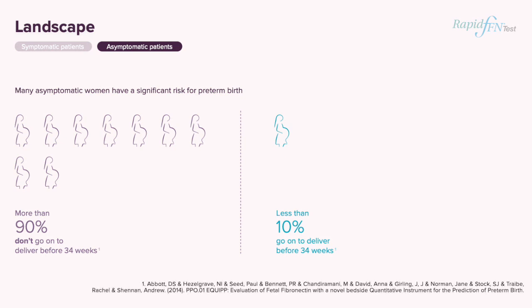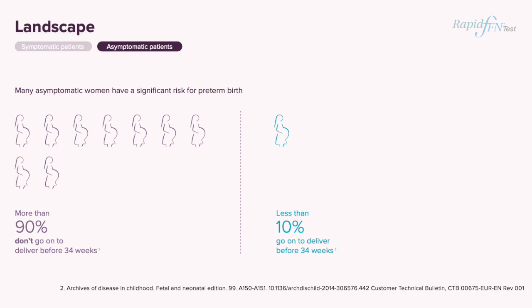I mentioned before that quantitative fetal fibronectin has further advanced in assisting with the management of the risk of preterm labour in high-risk asymptomatic women, and is licensed for use between 18 and 27 plus 6 weeks. These women may have a history such as a previous preterm delivery, cervical surgery, or a shortened cervix. Together with a cervical length measurement, maternal fetal medicine consultants have been able to better manage these patients by setting up surveillance plans, with the ideal outcome of returning many of these women who are deemed low risk for a spontaneous preterm birth back to routine antenatal care.